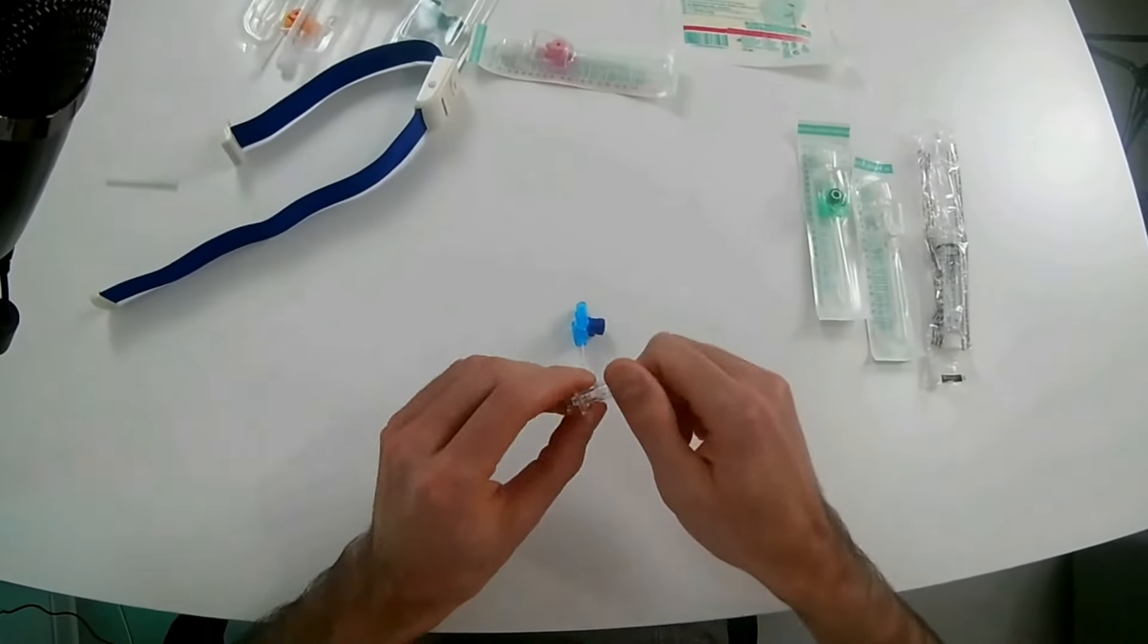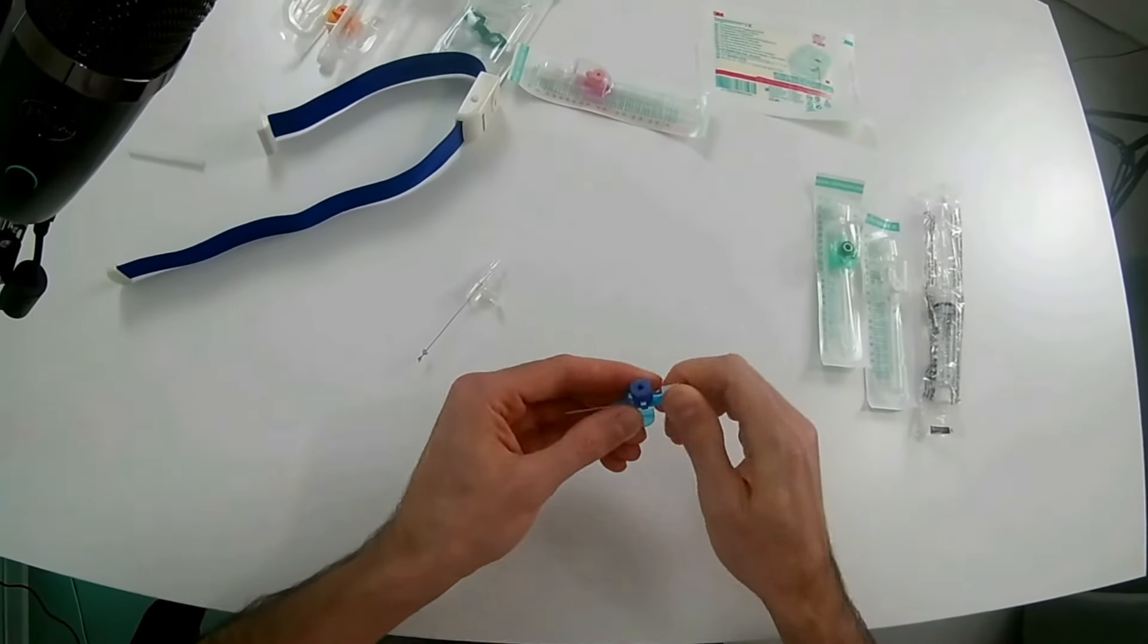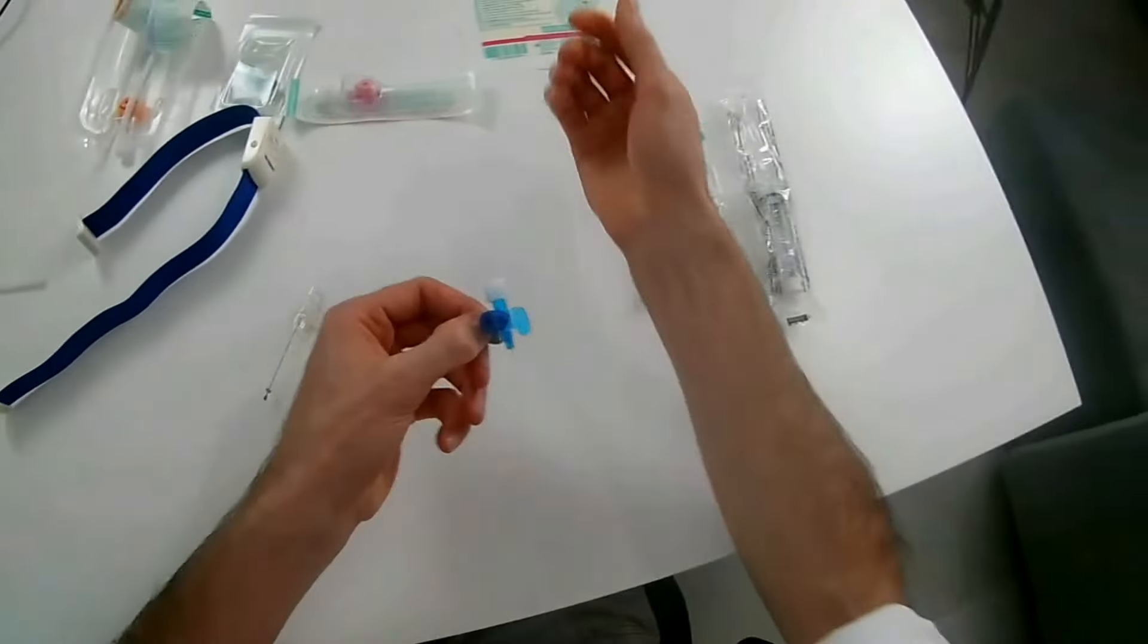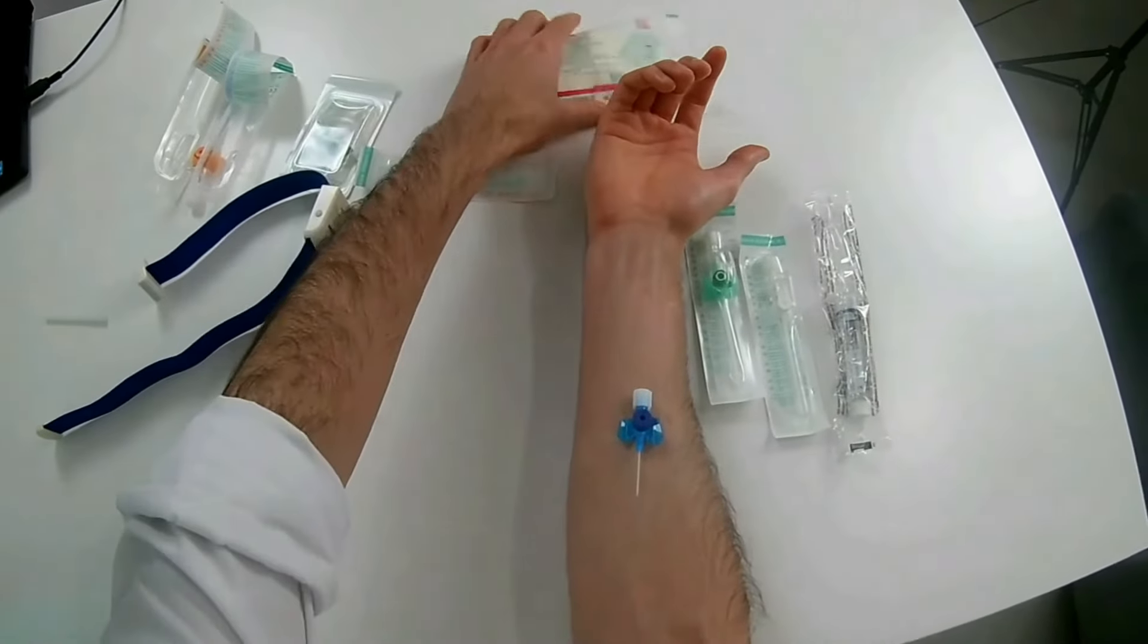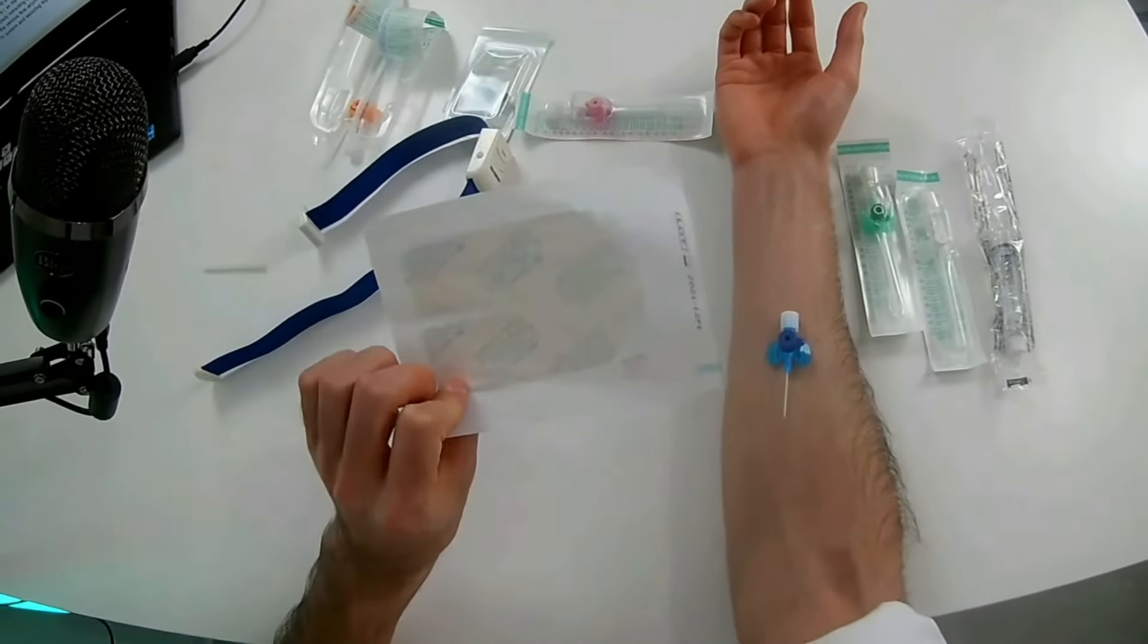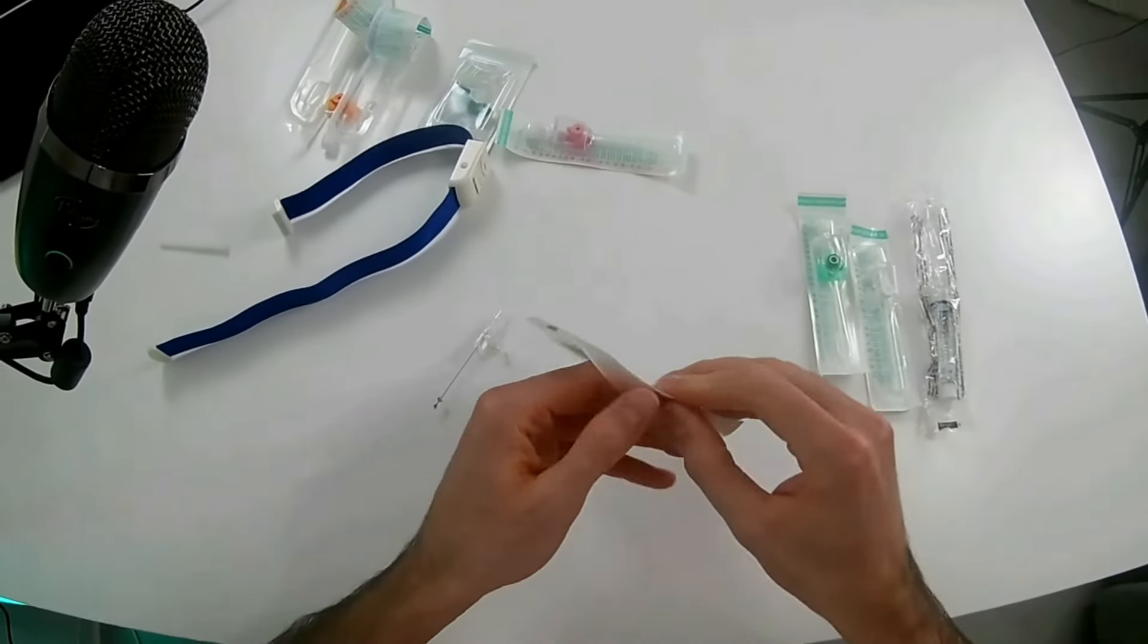And connect this to a system of saline, for example. If you don't have a system for a short time, you can use the back of the catheter of the needle to close it, and so it would stay like this.